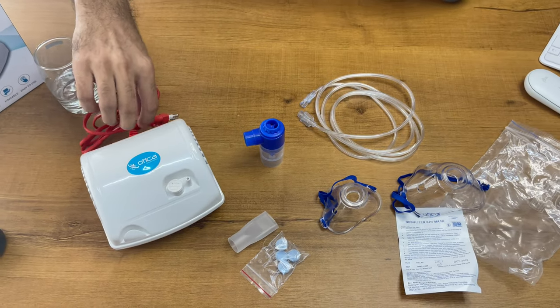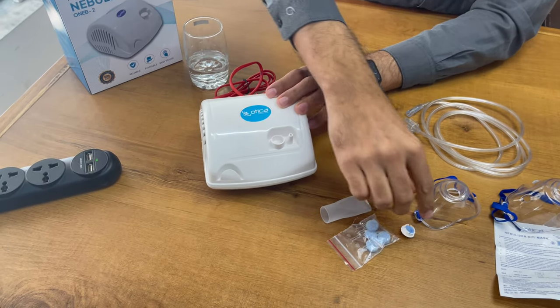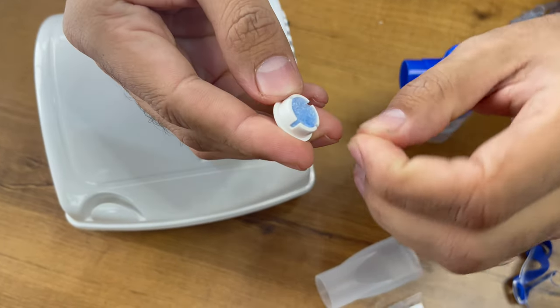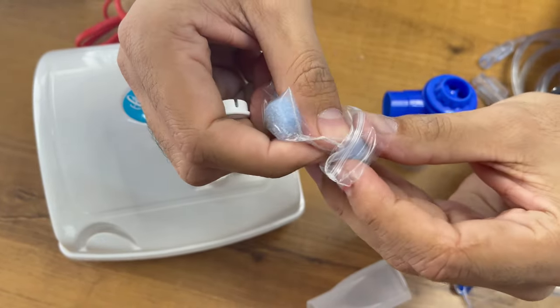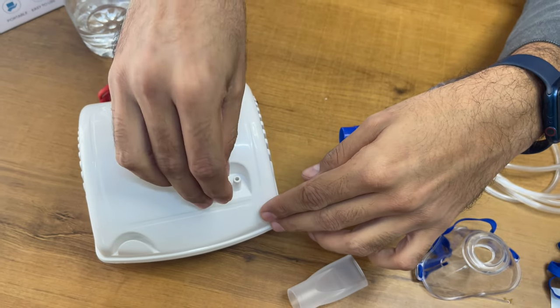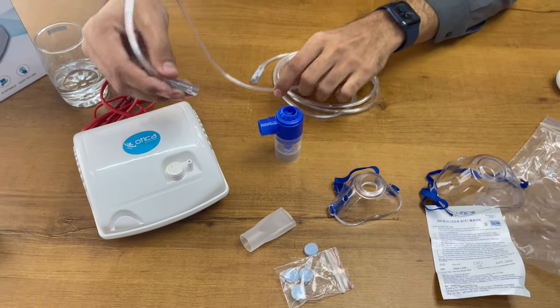This is the main machine. You can change the filter from here — you just need to remove this knob and remove the old filter. You can add a new filter from the four extra filters provided. This is the air inlet filter, which provides pure air inside the compressor, and that pure air will then be delivered to the patient.